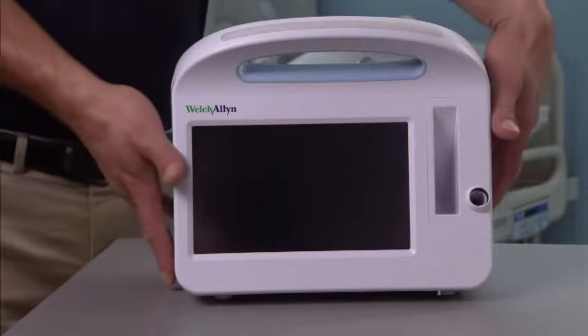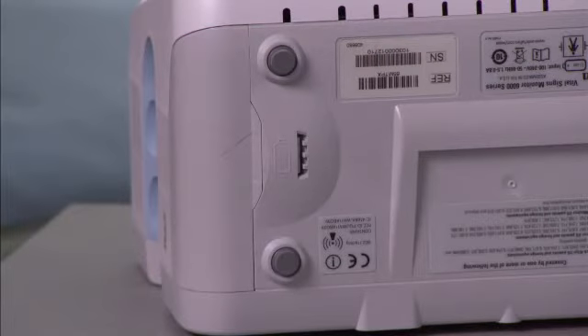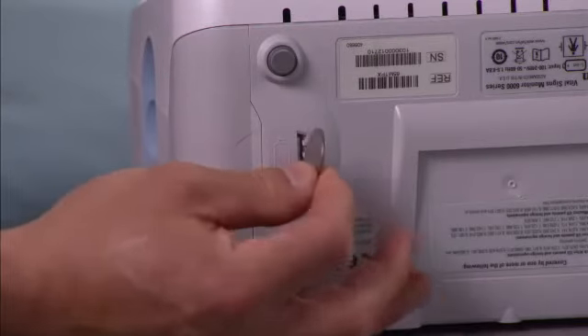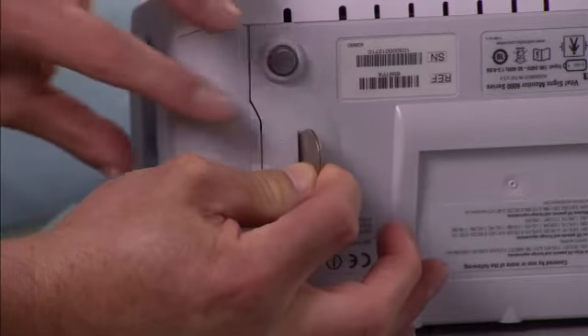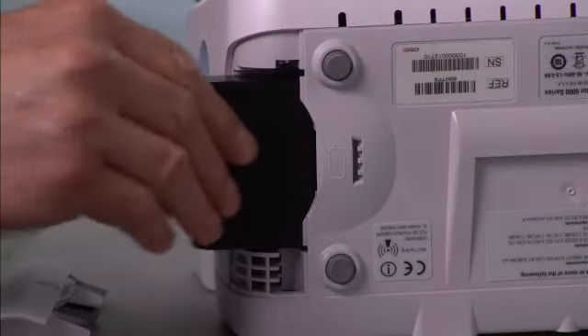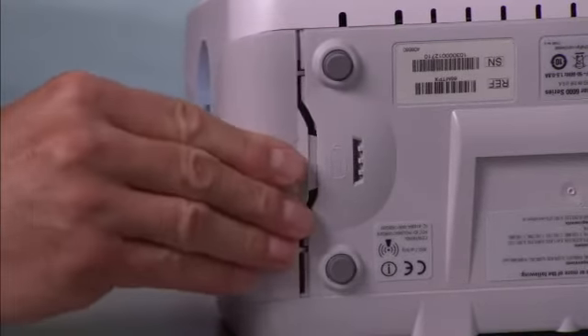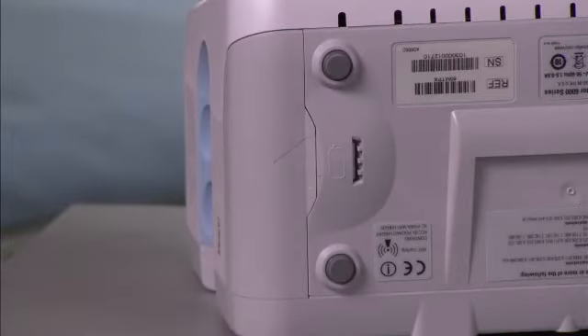Turn the monitor upside down to access the battery cover. Locate the battery indicated by the battery symbol. Insert a coin into the slot and push to open. Slide in the battery. Replace the battery cover by inserting one end into the notched access and then pressing firmly on the opposite end.